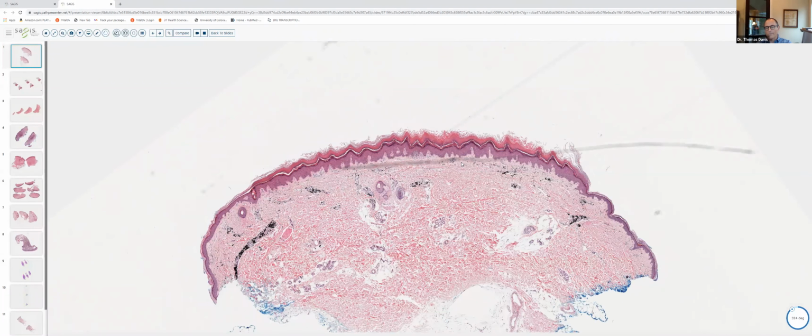So the presence of scar, fibrosing granulation tissue, and again, the presence of aluminum chloride can be a useful clue to the site of prior procedure. And you want to make sure you recognize this. There's really not much of a brisk host response, and this certainly will not tattoo the skin like Monsel solution. So there was a shift a number of years ago from routine use of Monsel's or ferric subsulfate to aluminum chloride for hemostasis. Okay, let's go ahead and move on to slide 4.